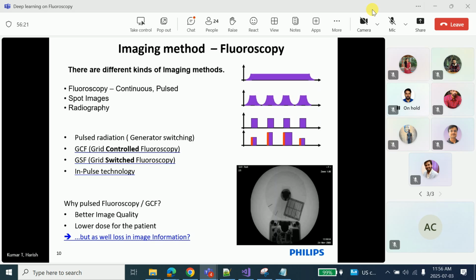But that realization takes place after a few pulses, maybe 2 or 3 pulses. So in these 3 pulses, can you see here, the ramp up is there. They are soft radiation, which can impact the image quality and produce unwanted radiation dose to the patient. So before it goes to 70, it takes 40, 50, 60, and then goes to 70.